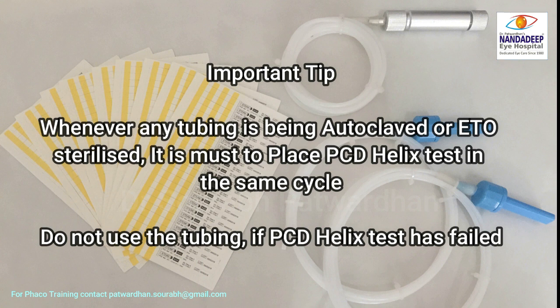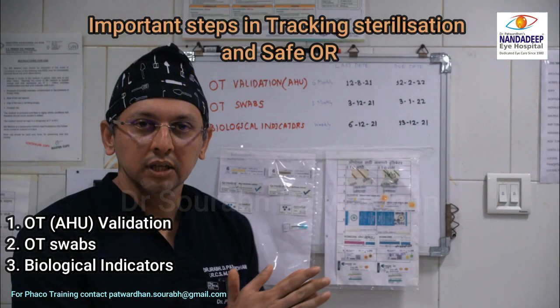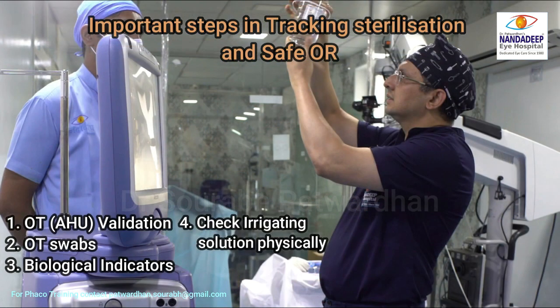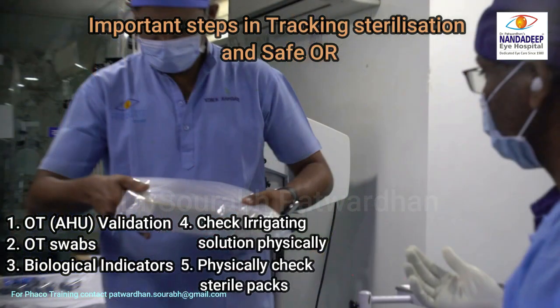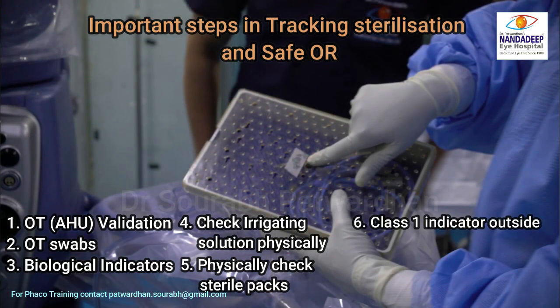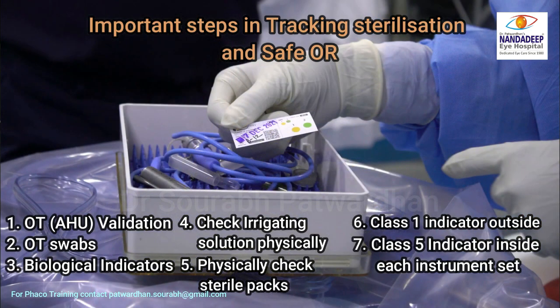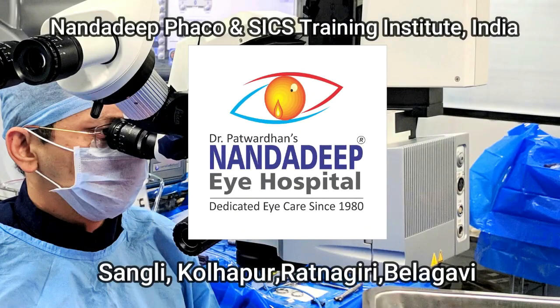These are the important steps for tracking sterilization and ensuring a safe OR: first, OT validation; OT swabs; biological indicators. Then check the irrigation solution and other packs physically. Always use a class one indicator on the outside of the pack and a class five indicator inside, so you know that a complete and effective sterilization process has been performed on that particular instrument.